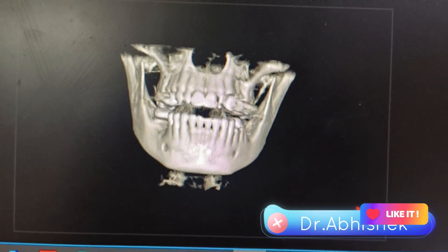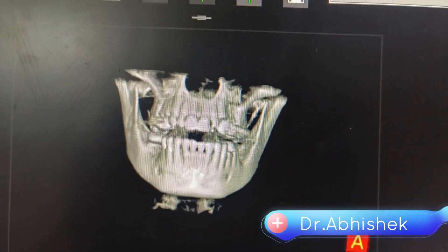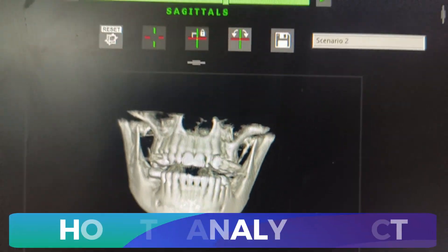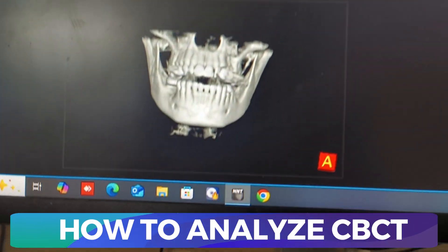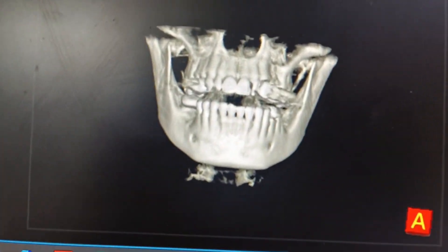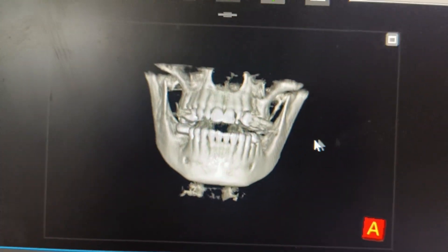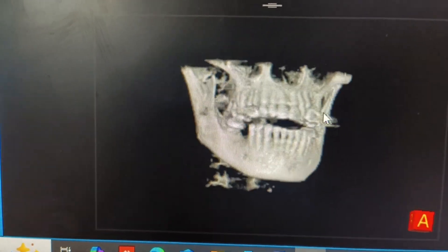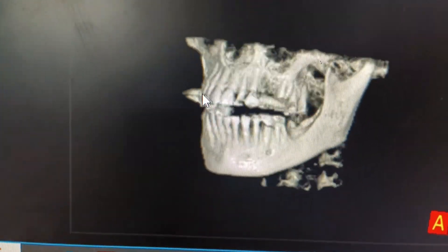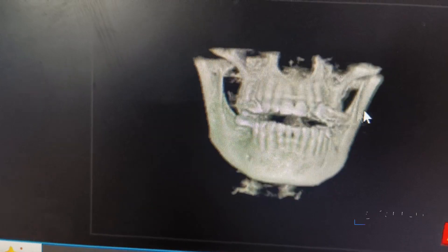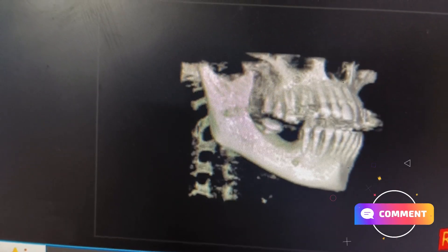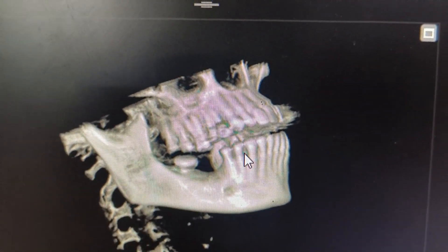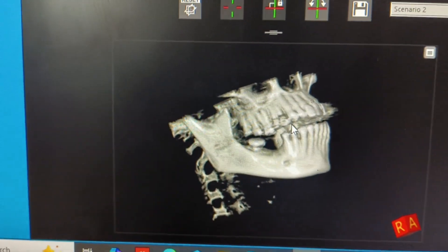A lot of you asked me to explain how to interpret CBCT. Today I'll show you the interface. As you can see, this is the volumetric representation of a patient. You can see a missing tooth at 37, and 46-47 is also missing.